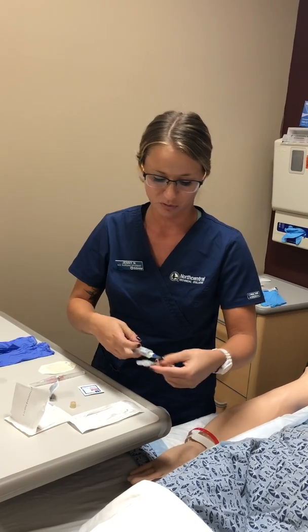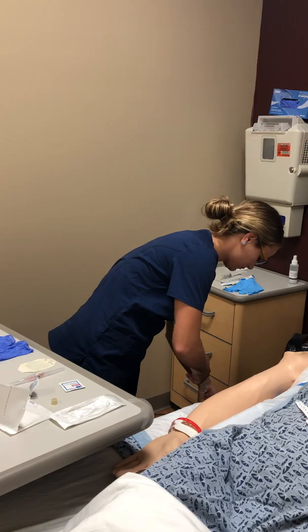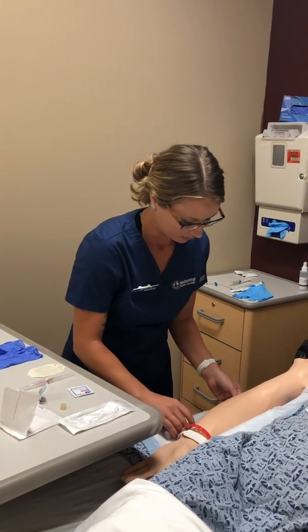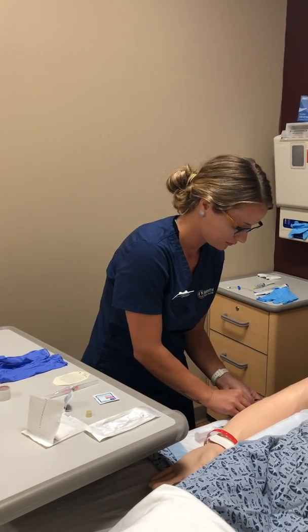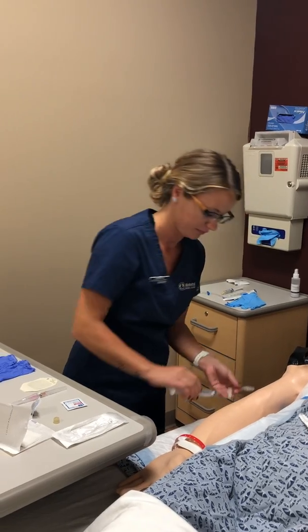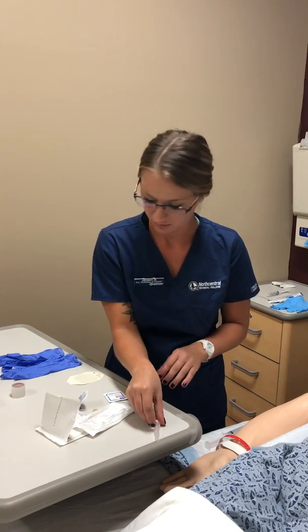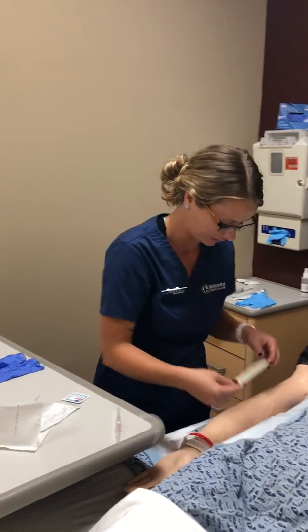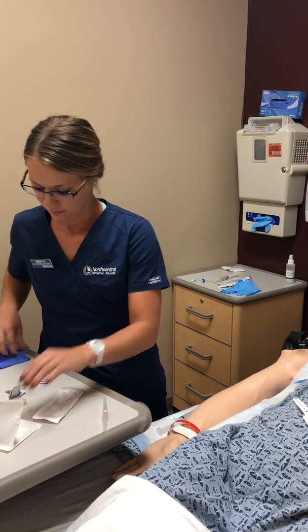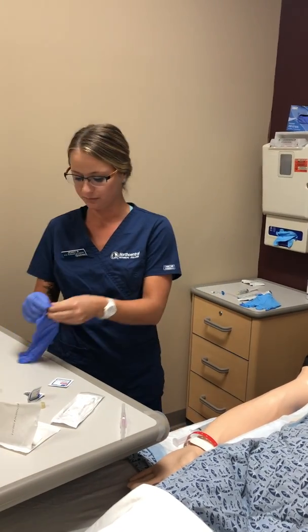And I just want to make sure to prime the tubing so there's no air that gets in. Looks good. Just going to set that right there next to you, Mary. Just check that was locked. Okay, I have my needle right here. I have my dressing ready. I'll set that right next to her. So I'm ready for that. Okay. And I'm just going to go ahead and put my gloves on here.